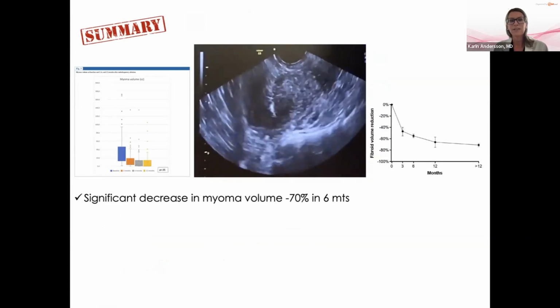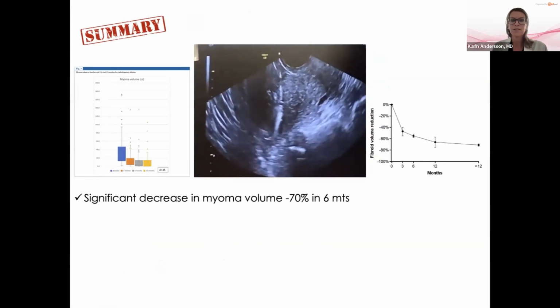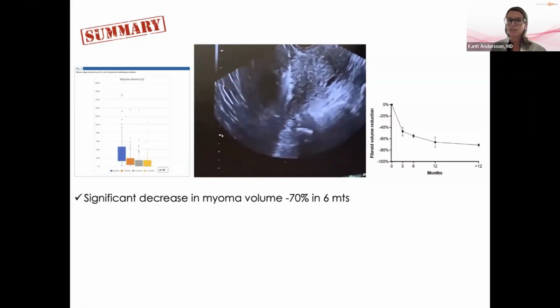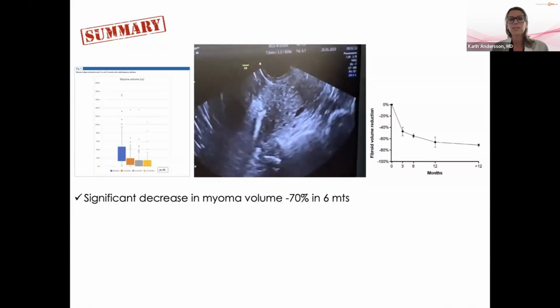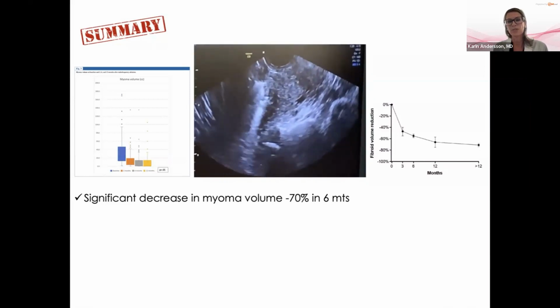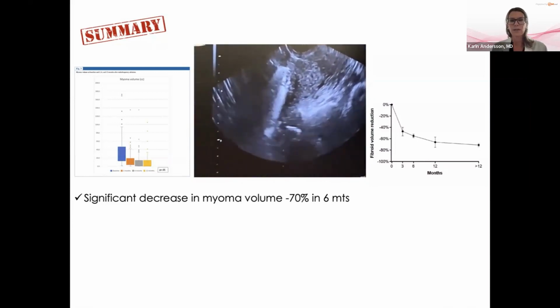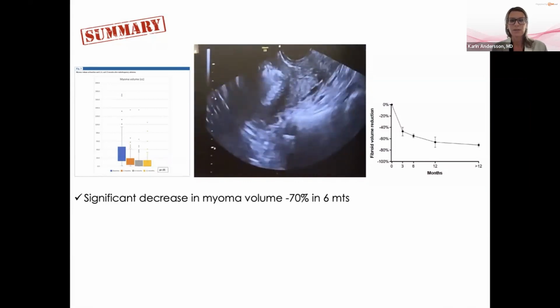As I said, the other day we called in, it was 3 months, an isthmic myoma that had been treated by hysteroscopy, not resolving because it was difficult with the angle. It was a little bit more than 3 centimeters. We did that in January, and we called in for a checkup last week, and it decreased by 90%. It was almost difficult to see. We had to make a 3D ultrasound to really discover where the fibroid originally had been. So actually, 70% is a mean, but you can have more results.